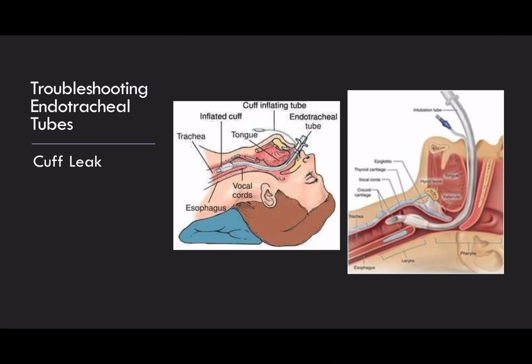This patient is at very high risk of self-extubating and therefore needs this tube to be advanced into the trachea very rapidly. Again, you need to call for help early. So, if you've got a patient with a cuff leak, this needs to be addressed by a senior airway trained doctor early, because the risk is either that you're going to aspirate, because remember that cuff is the only thing that's there to prevent oropharyngeal secretions from going down into the lungs.